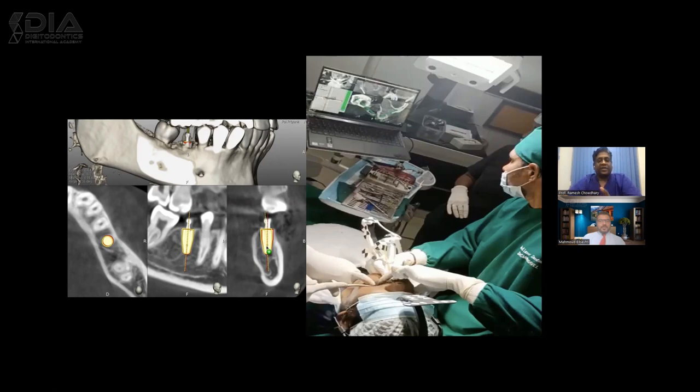So even now it's becoming like that, these small errors are looking big for us with the digital involvement. We know that we have to achieve, because software doesn't understand what is 0.6 or 0.2 or 6 mm. For us 0.6 today is nothing, but still it calculates and tells us that you are away by 0.6 mm. So that is the amazing feature of a digital thing. It still makes us think, oh, we have missed out, 0.6 mm of error is there.